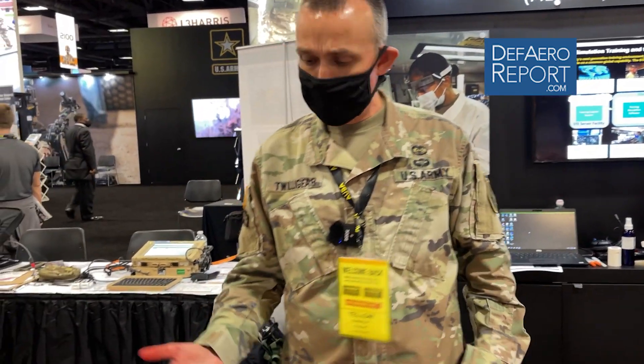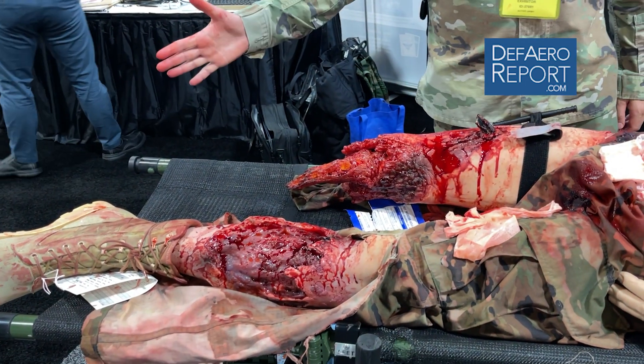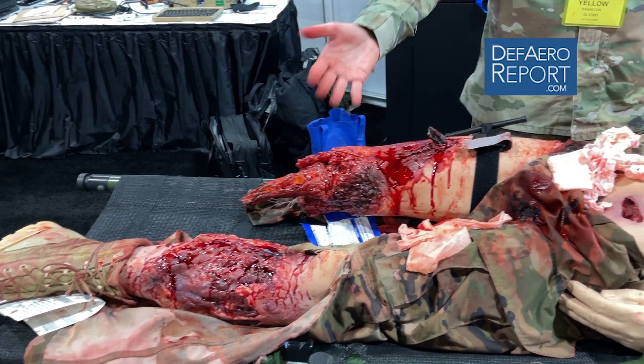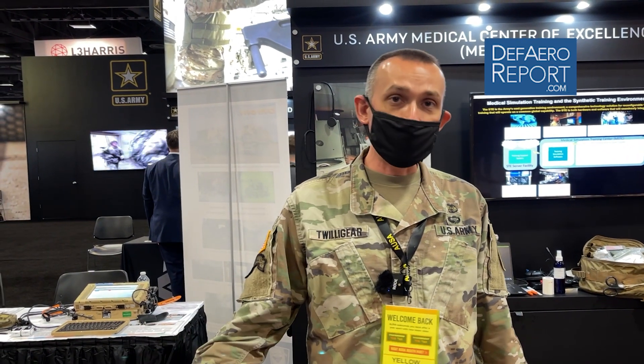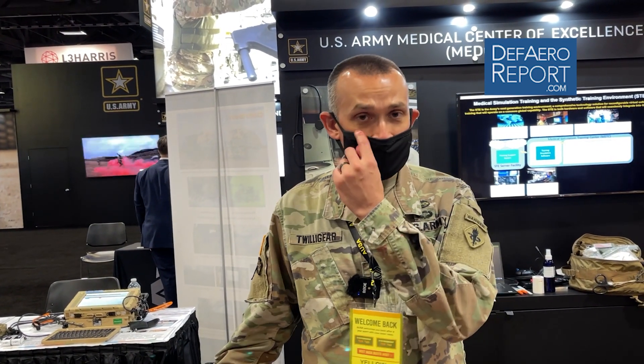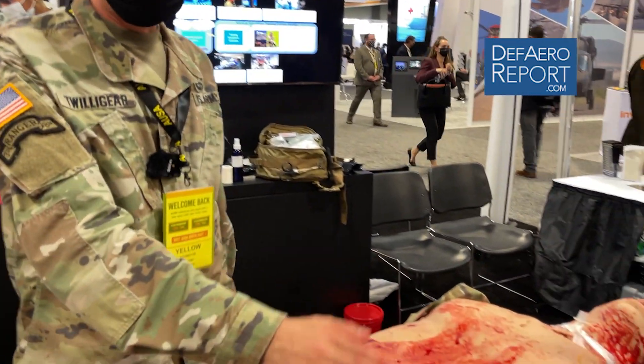If we look at the wounds here, this is very similar to a dismounted pressure plate IED — it shears up that leg, shreds the back one. Well, how often do you see an IED all by itself? So there may be more IEDs around it. There may be a crew-served weapon serving overwatch on that IED. Any of those things may dictate at a unit level that we don't go to save this guy. Or maybe this is my vehicle operator and we have to work him out of a tank.